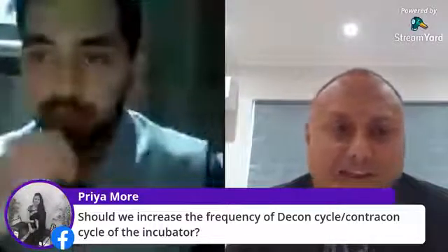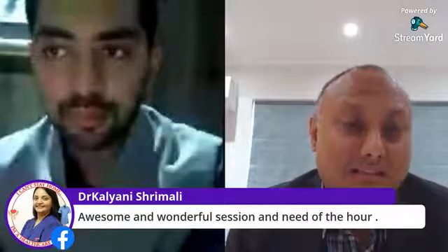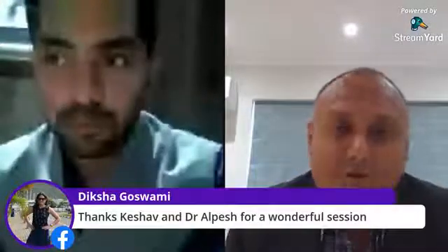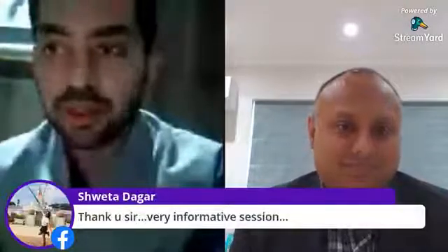So you see, generally nowadays we don't recommend culturing embryos in big box incubators, and the Contracon is more of a big box incubator setup. So if you are using the big box incubator to culture your embryos, then yes, please do increase the frequency of your Contracon, because everything that you can do in addition is an added advantage. Yeah, that's true. And I think, again, taking maximum precautions without compromising on the health of the laboratory is something that we have to consider. Contracon does damage the sensors a bit. So yes, increasing the frequency of that, you have to be worried about your sensors.